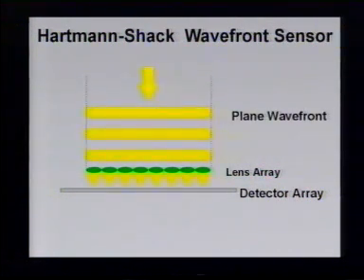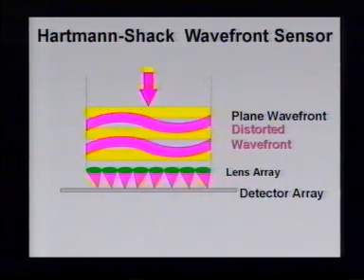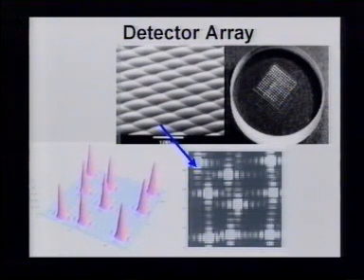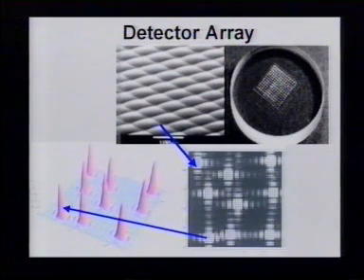The spatial phase distribution in this wavefront is investigated using a Hartmann-Shack sensor, which consists of an array of microlenslets and a CCD chip detector placed in the focal plane of the lens array. Each lens defines a subaperture focusing a small portion of the incident wavefront on the CCD sensor, leading to a pattern of focal spots on the detector surface. This pattern contains the information about the spatial phase and intensity distribution of the incident wave.